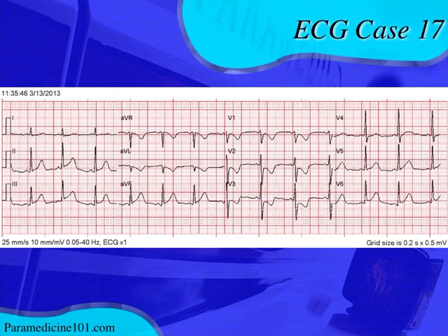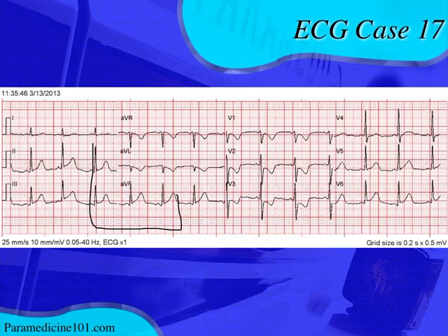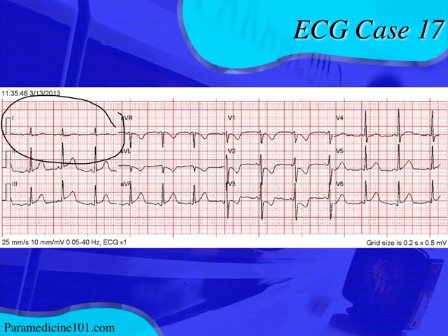Here's the 12-lead obtained from this patient. Right off the bat you can see that it is not normal. Let's start with the rhythm — it looks to be a sinus rhythm. You have a P-wave for every QRS complex, it's within a normal rate, you have upright P-waves in the limb leads and negative P-waves in AVR, so it looks to be sinus. Looking at the axis using the quick quadrant method, lead I is positive and AVF is positive, so the QRS axis is normal in the frontal plane.